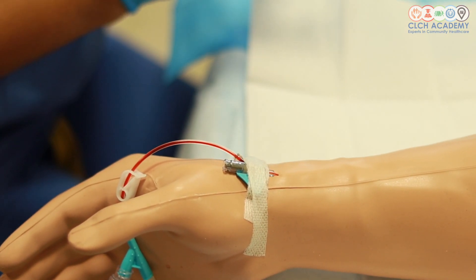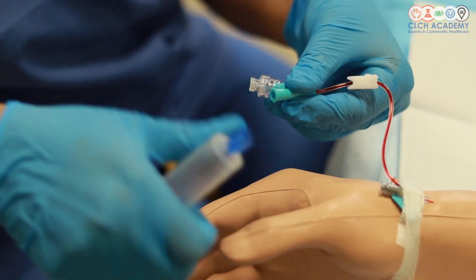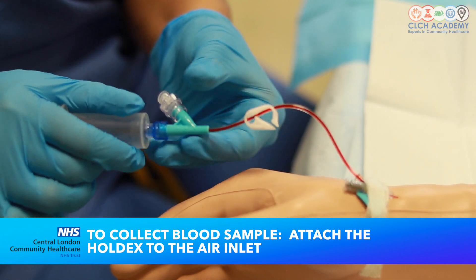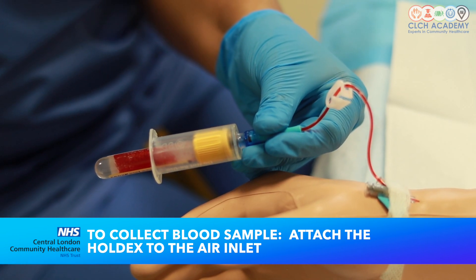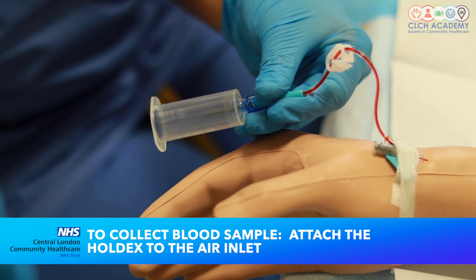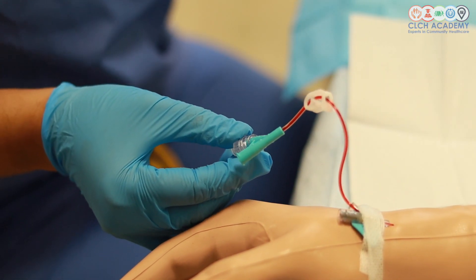Now let's say I was going to collect my bloods — I can attach my holdex to this and then unclamp to collect my bloods, and introduce my bottle for blood collection. You can see that it's filling — that is if I thought I needed to collect bloods at the same time as inserting my cannula. Once that's nice and full I can invert it five times and then clamp and remove my air inlet and my holdex.